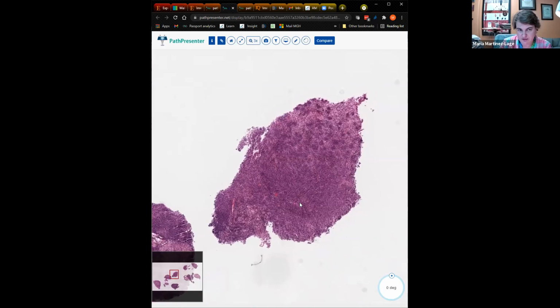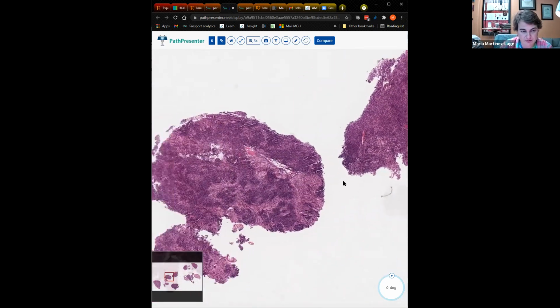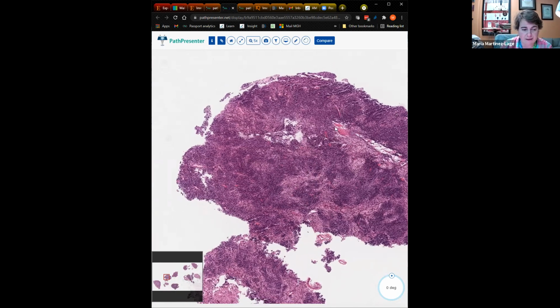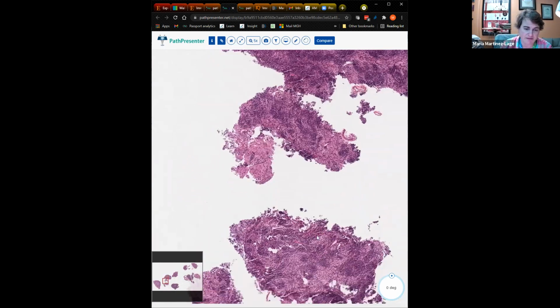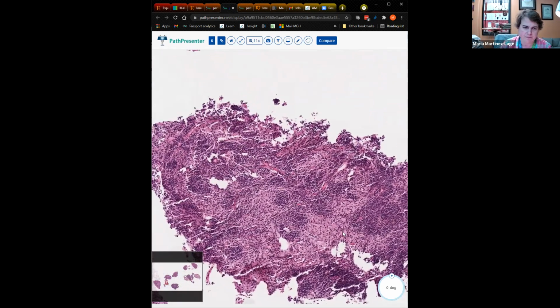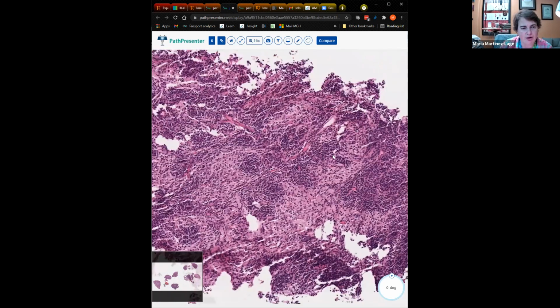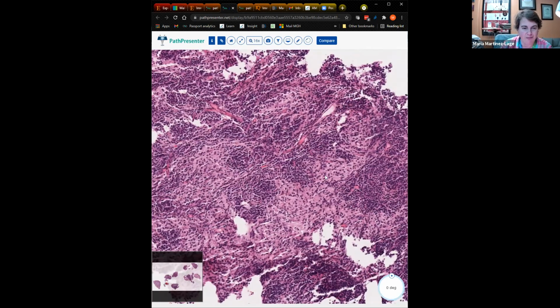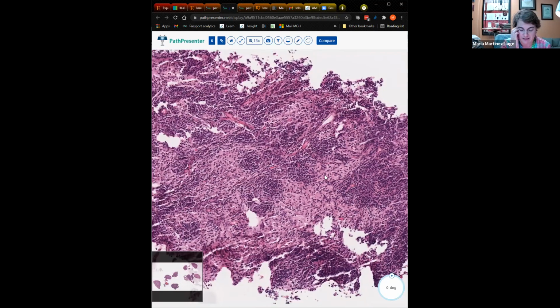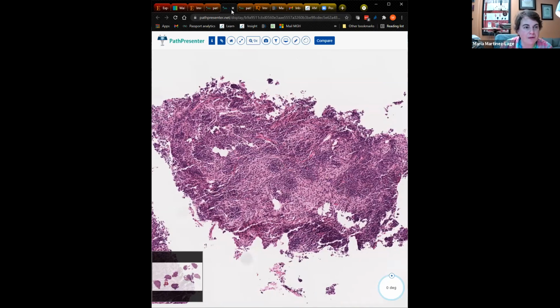So again, if you have a histological diagnosis, that's sufficient. If you have the ability to do some molecular testing, what we do is we do beta-catenin and look for any type of nuclear staining, which would basically signify that it is a Wnt signaling pathway activated tumor. And then you can do other types of immunohistochemical stain to help identify sonic hedgehog activated tumors, whereas group 3 and group 4 are usually identified by molecular testing of different ways.